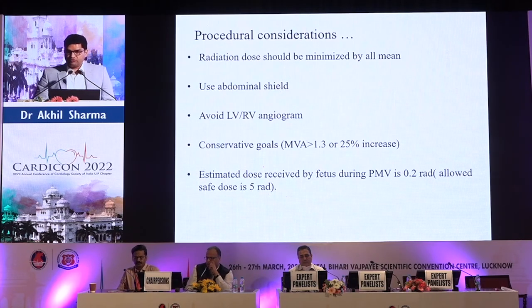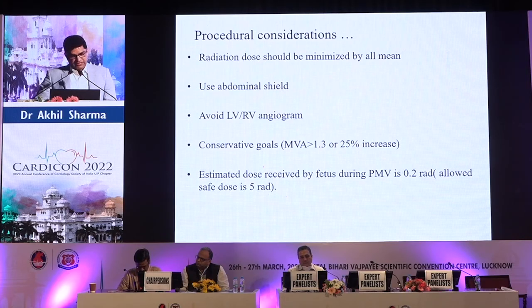Should we do this patient in the first or second trimester? Don't keep the patient waiting in a long fast. Complete your procedure as soon as possible. Never try for the best result; a suboptimal result is well accepted, and going without MR is your priority.